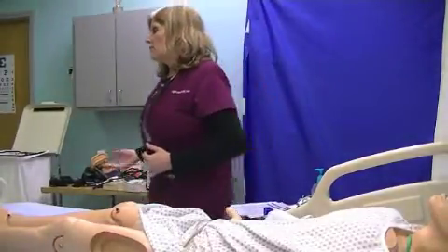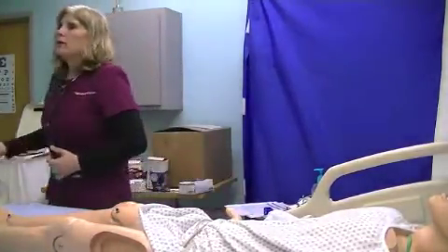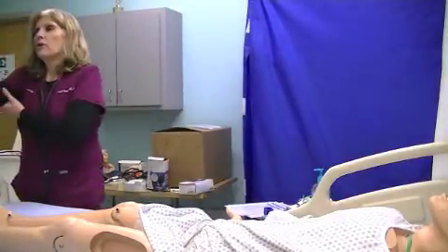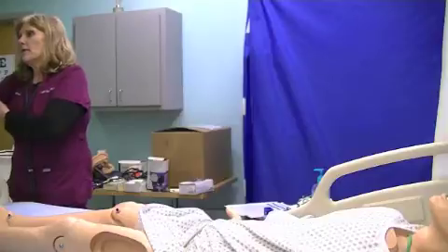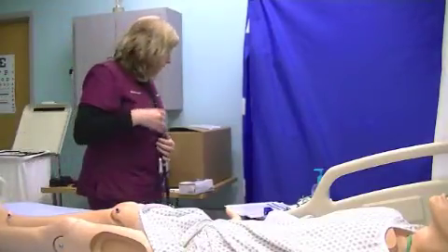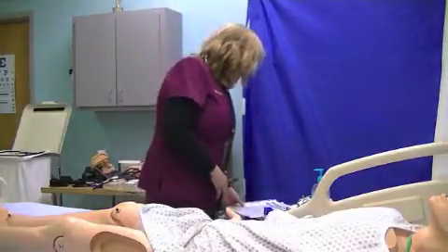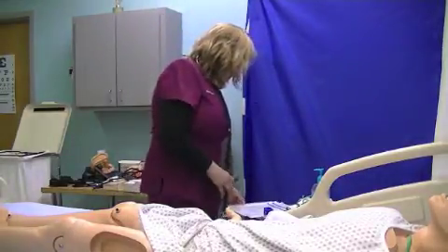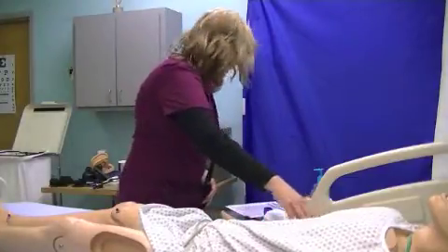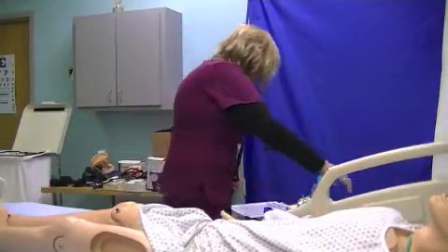If they're sitting in a chair, you want to put a table next to them to keep their arm elevated at heart level, unless you want to hold it. But I would recommend using an overbed table, putting it up to their level, keeping their arm elevated at their heart level. You want to make sure you roll up the sleeve about 5 inches, so that you don't listen over clothing.